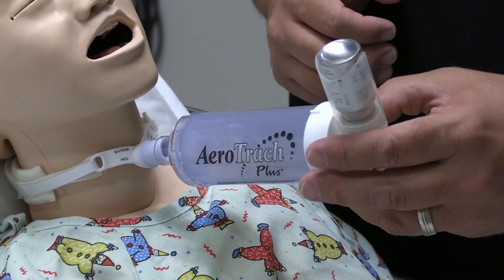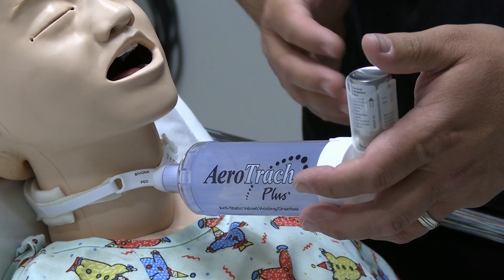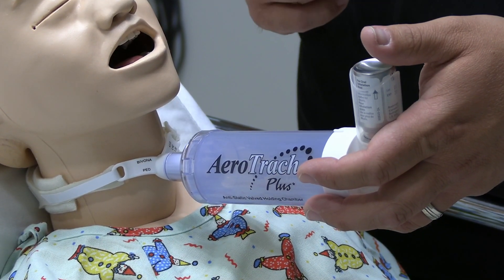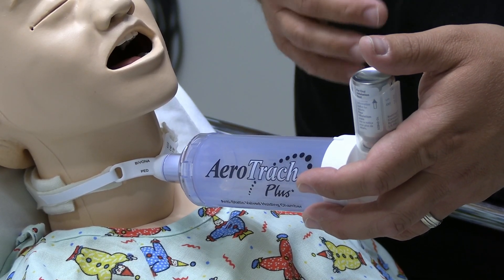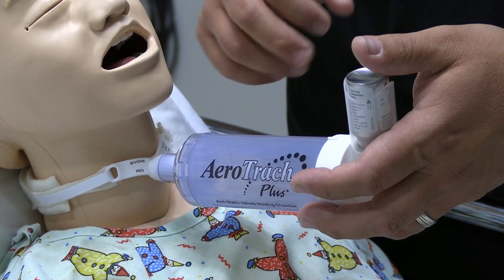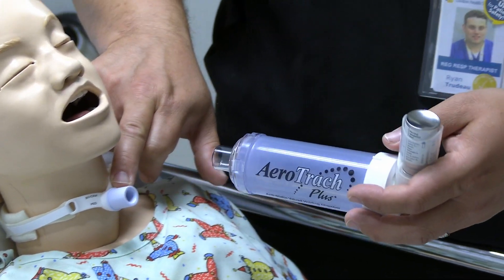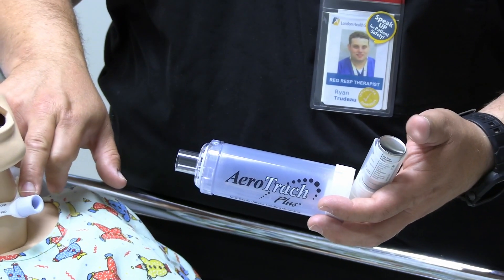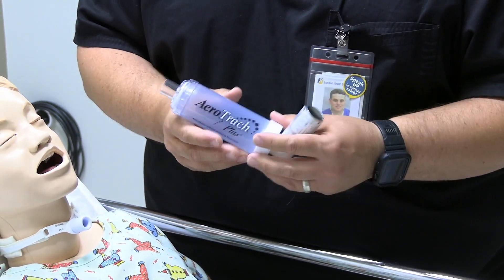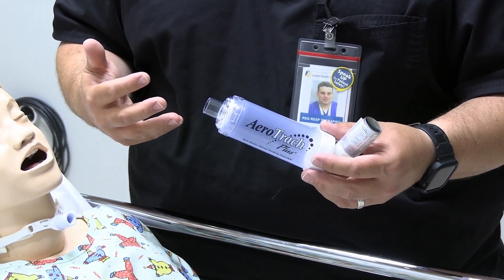Go ahead and attach it to your patient. Depress the medication to deliver a puff. Just like the mask aerochambers, allow five to six breaths. Normal tidal breathing is fine to allow them to breathe in all that medication. When they are done, hold down on the flange of the tracheostomy tube to ensure that you're not pulling it out. Then shake your medication and prepare it for the next puff. You will do that for every puff that has been prescribed.